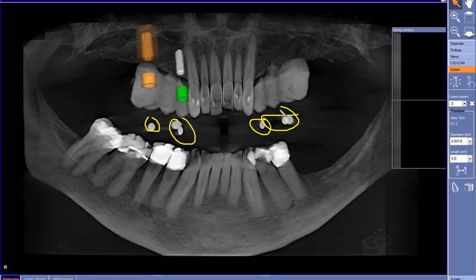So my first question is going to be, what are the three types of guides we can do? Number one is a classic guide, number two is the opti guide, and number three is the CEREC guide. Obviously this case is not a very good case for CEREC guide, so we're going to go ahead and throw that out the window. And then really the big question, and 95% of the time the question is, does this need a classic guide or can we do an opti guide? And this case is done correctly. This is a case where we really need to do a classic guide.